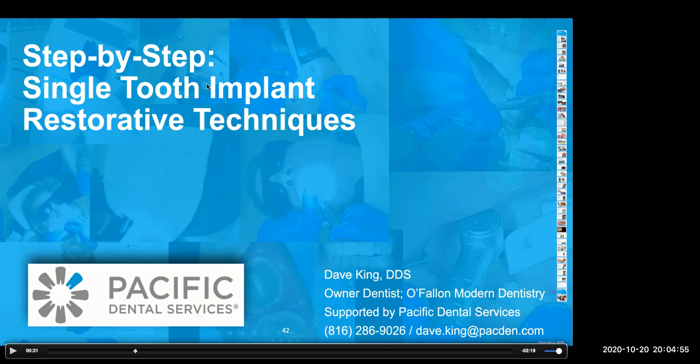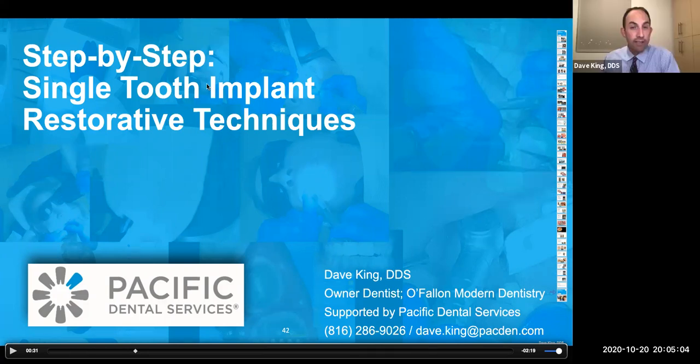All right, and next question. In a single restoration in MIP, shouldn't be any contacts in working and non-working? Right, yeah, so basically a single implant restoration, what I'd suggest is the only contact they should have is a maximum clench, when they maximum clench. So all the other teeth are gonna meet first, then the implant will come together last in maximum clench. And then when you guide, when you slide, working, non-working, protrusive, retrusive, all these movements, there should be no drag marks on that articulating paper.